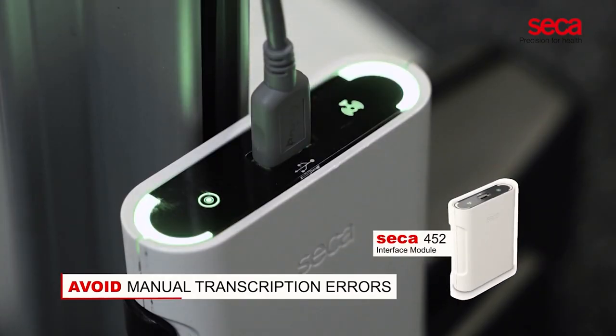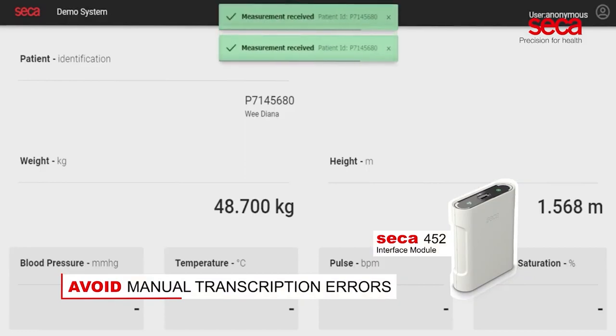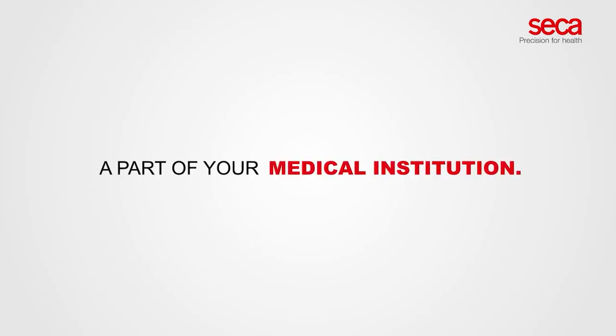When equipped with the optional Sika 452 interface module and a barcode scanner. We just love the Sika 286 — ask us how to make it a part of your medical institution.